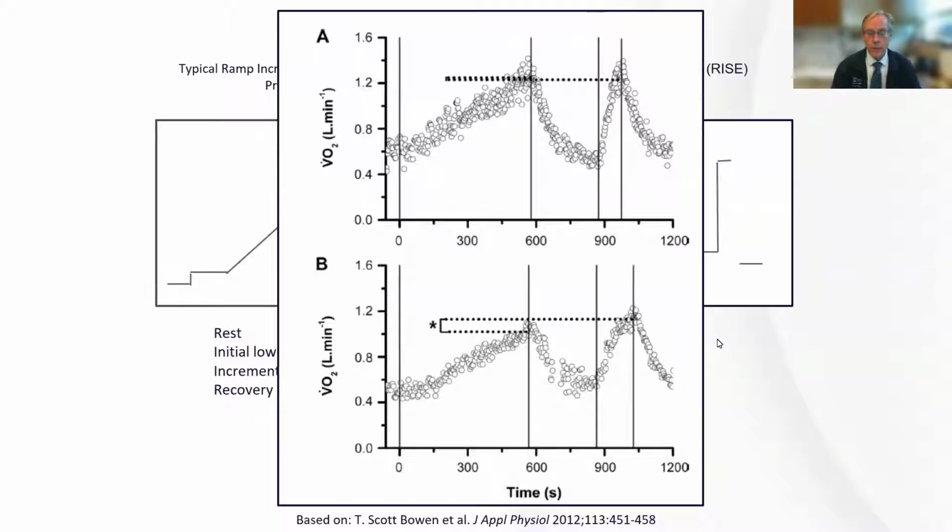So it's a little bit of terminology. It's a little bit confusing, but peak oxygen uptake is what you measure during your test. You're never absolutely guaranteed that that's the max. And of course, the amount of oxygen uptake is dependent on the type of ergometer. So bicycle versus treadmill, you're going to get higher numbers on a treadmill than a bike. So the oxygen uptake depends on the ergometer as well. This happens to be a bike.